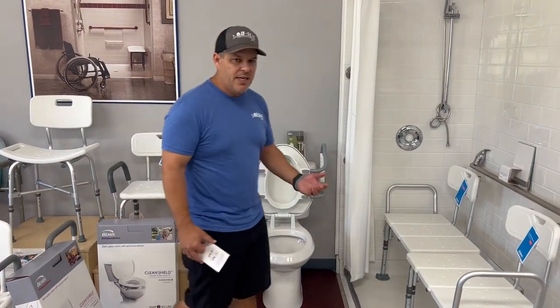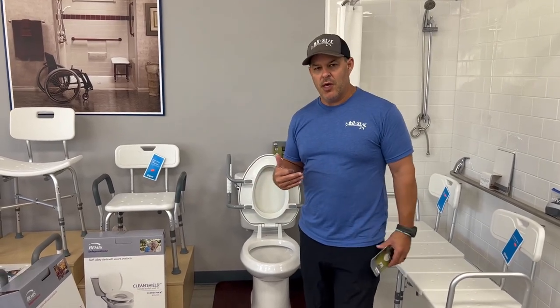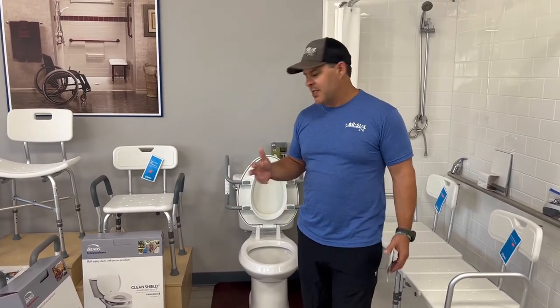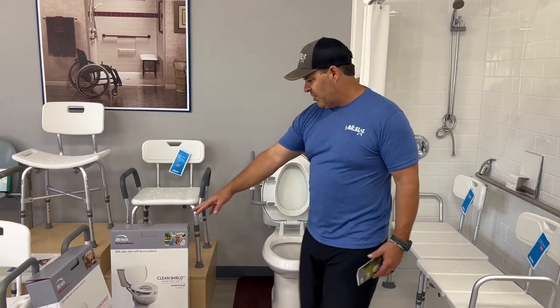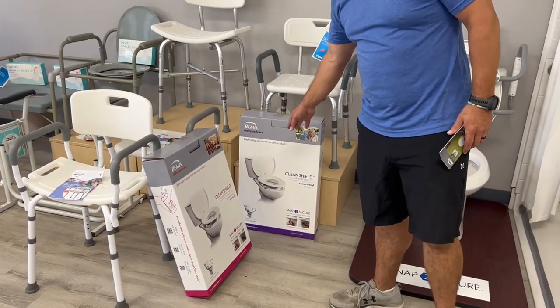The biggest complaint we get is how do I clean it, or I have to take it off because there are multiple people in the home and they don't want to be using it. This gives you the ability to adjust it. They make them elongated or round, as you can see on the packaging.